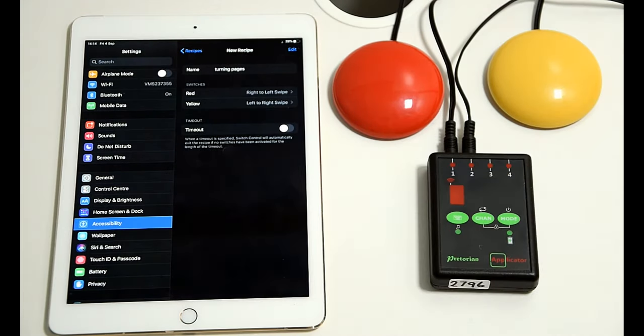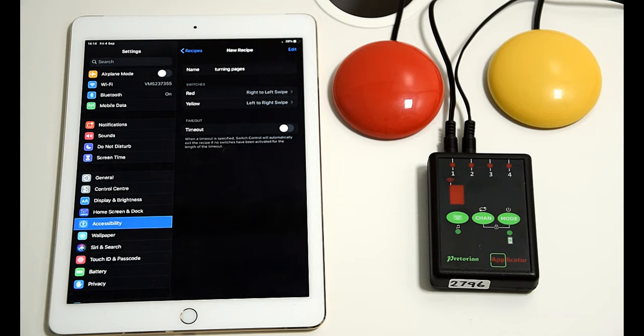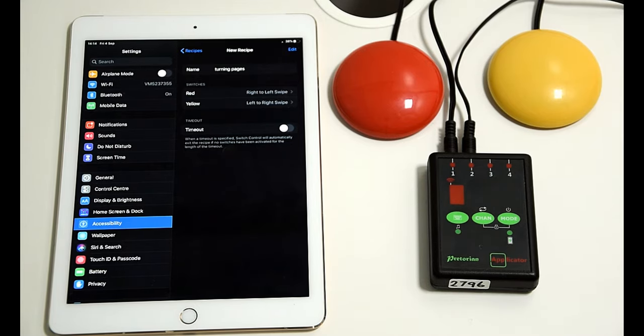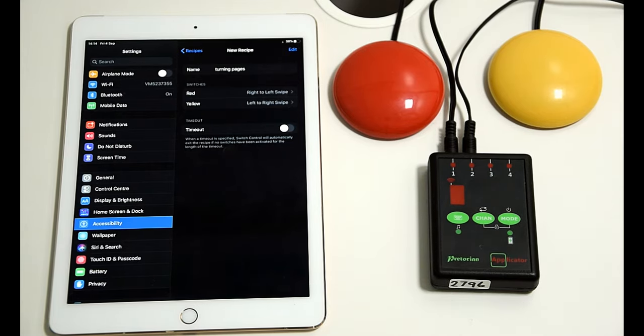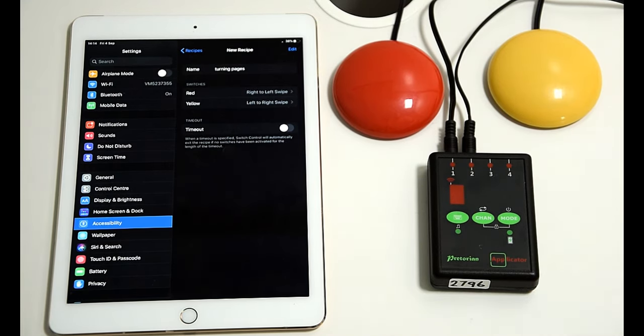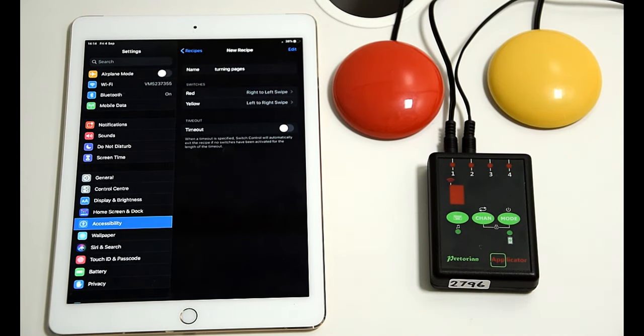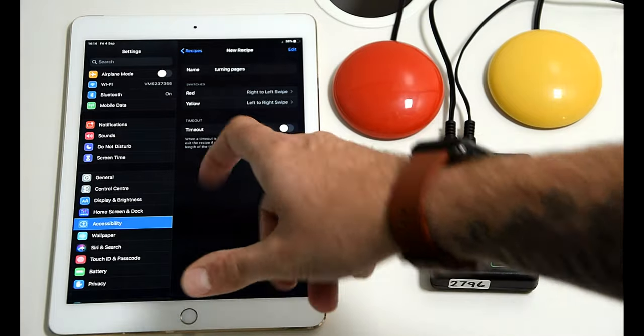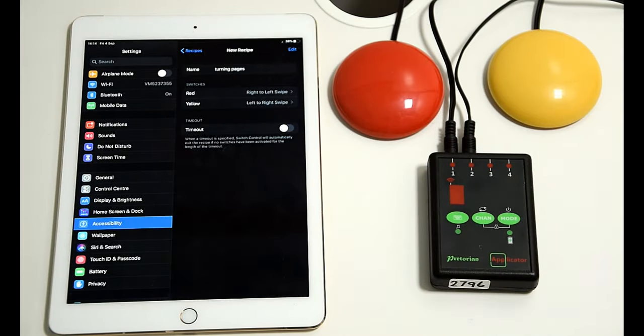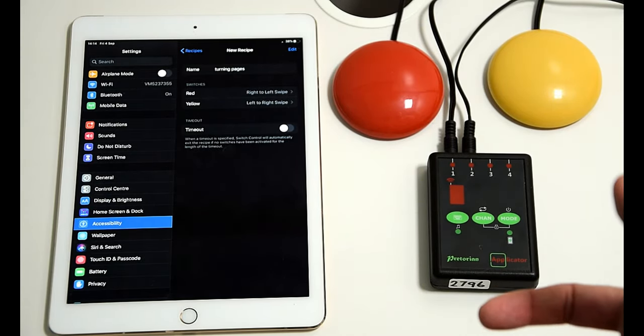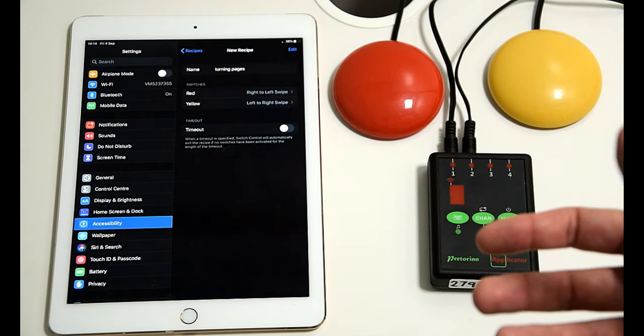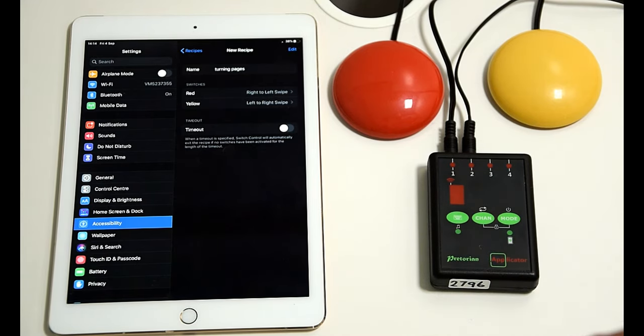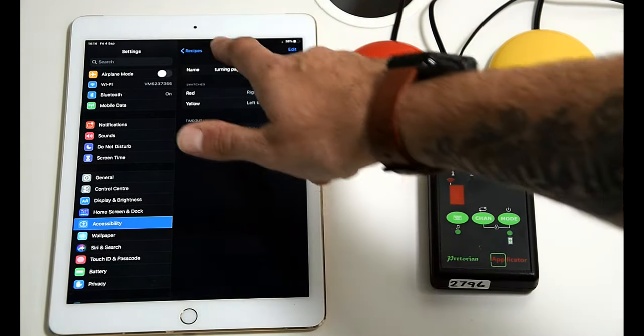Timeout you can use if you'd like to where switch control will exit the recipe if you haven't used it for a long time. But if you're turning a page and you're reading and someone might take a while with reading, it's best to leave that off really and just stay in that function. But if the timeout is on, after that given time, the switches will revert back to their previous actions that we'd set up before.